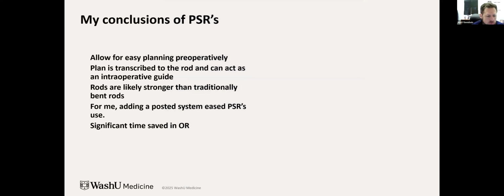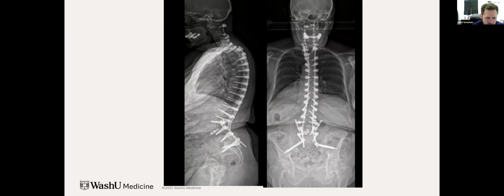And so on that one you had the satellite rods for your PSO custom made, and so when you start bending that, after you've done your PSO and you start correcting there, you're kind of using that as a template.